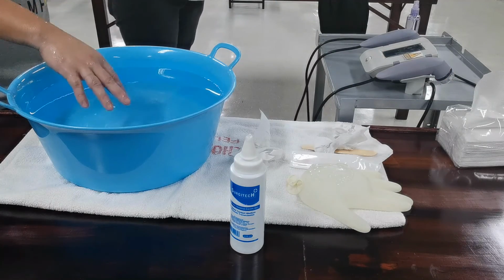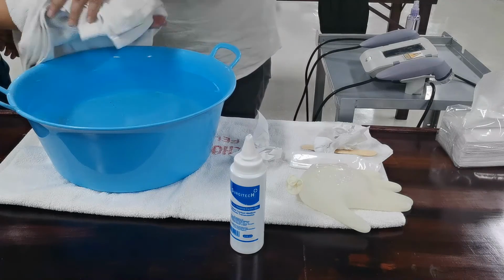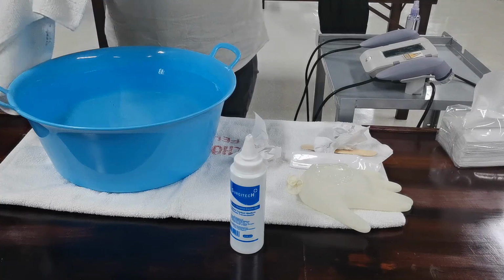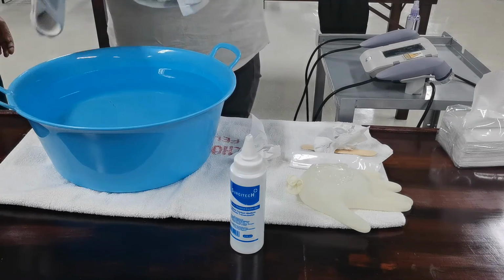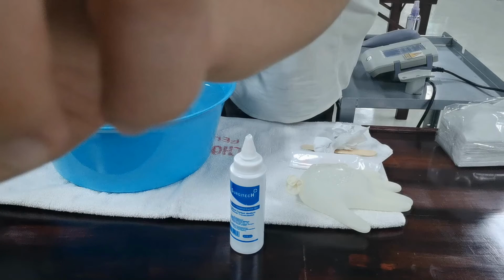So again, we perform aftercare using a towel. So this is a little bit messy as well.